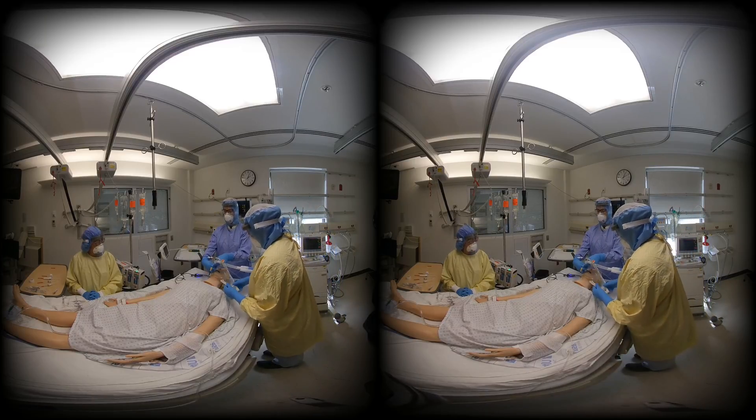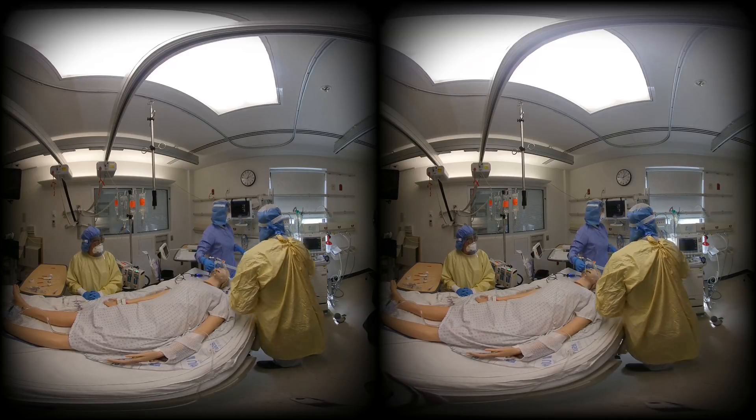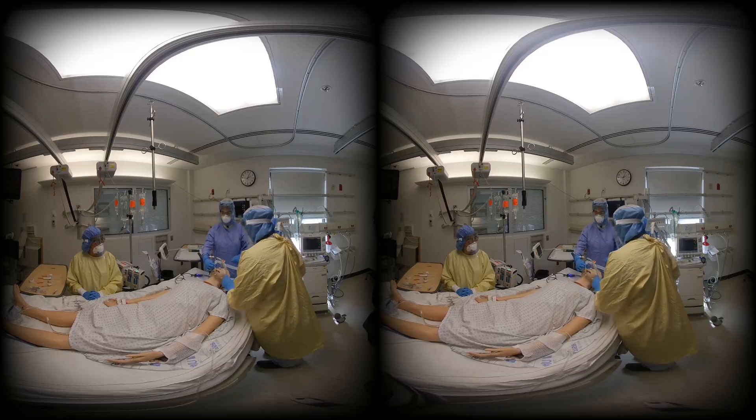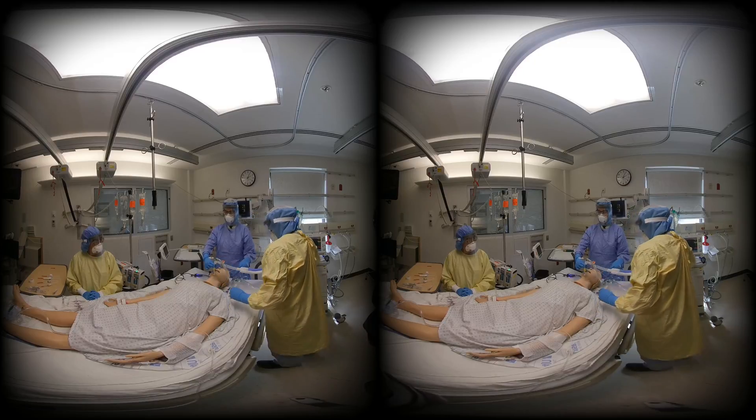At this stage, the nasogastric tube will also be inserted, to minimize the number of encounters. The sequence is now complete. If the patient is stable post-intubation, the team can exit the room and doff their PPE, as monitored by an observer.